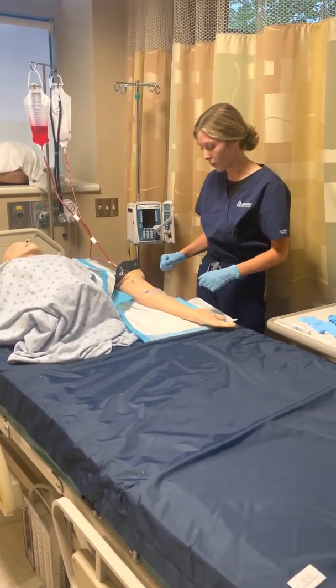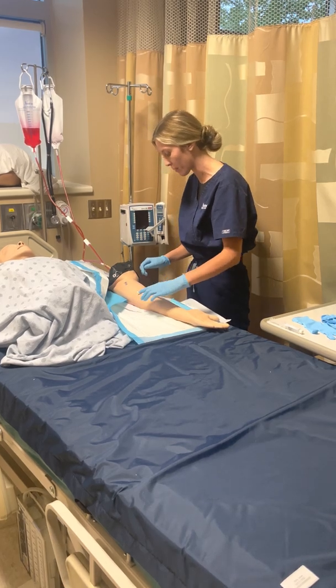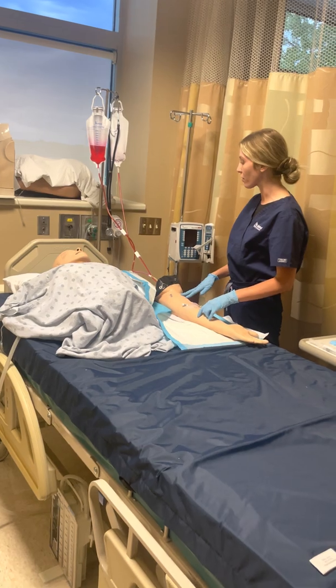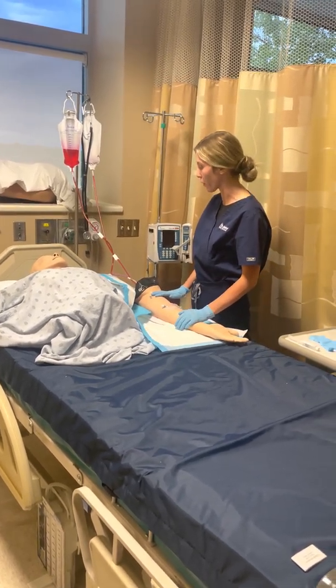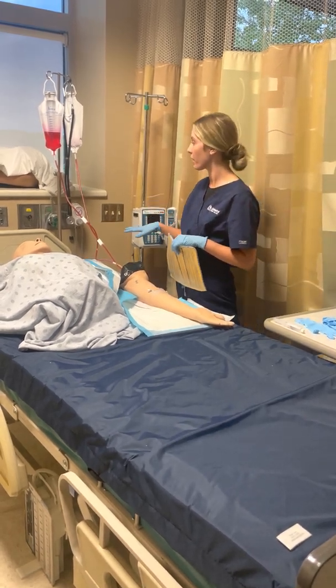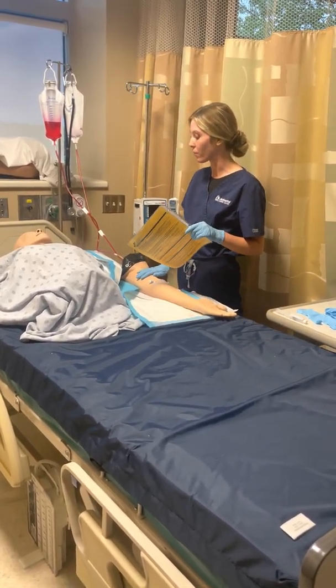All right, Betty. I am just going to do a quick assessment on you before we get started here. We just want to make sure that vital signs are stable and that lung sounds are clear, okay? Okay. All right, so we got you all hooked up to vitals, and it looks like your vital signs are stable and your lung sounds clear.